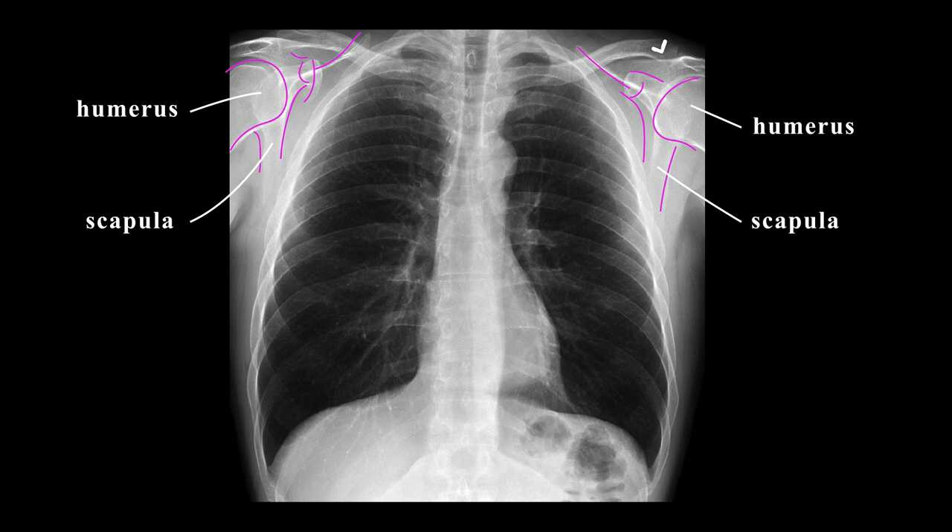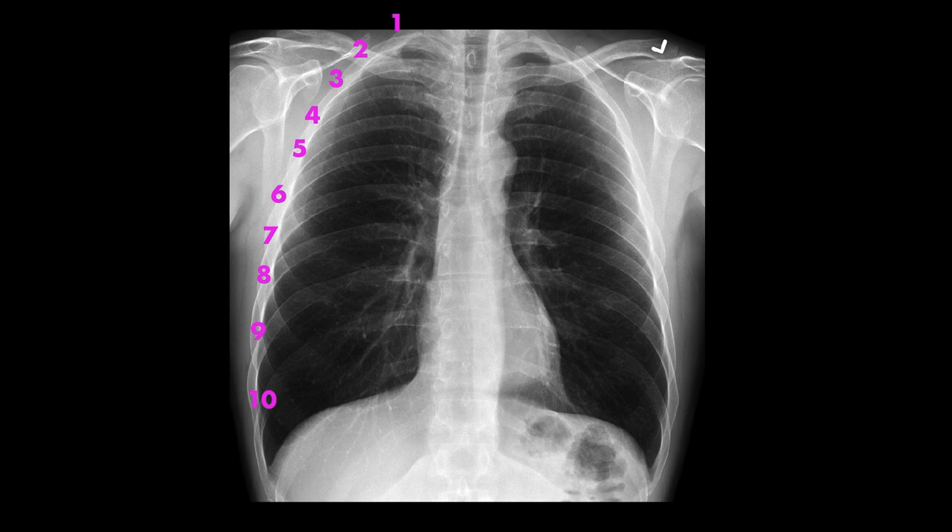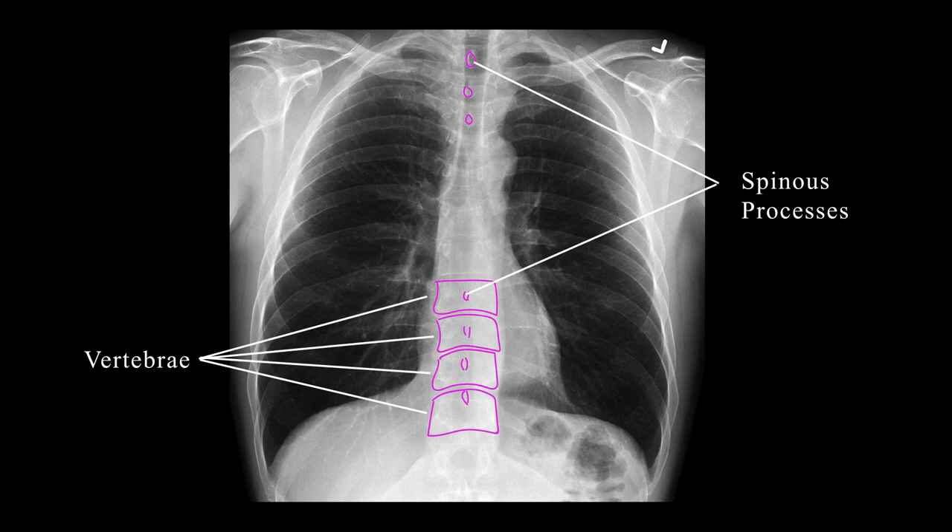The next set of bones I look at are the ribs. I usually quickly count them off myself, since this will give me an idea of whether or not the patient had enough inspiration when the x-rays were obtained to get the most optimal view of the lungs. Lastly for your bones, in the middle you will see the vertebrae and spinous processes. Note that you could even see the vertebrae behind the heart, which signifies adequate penetration of your film.